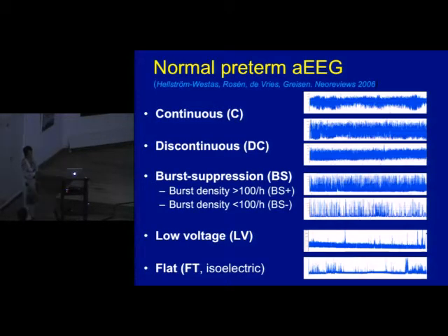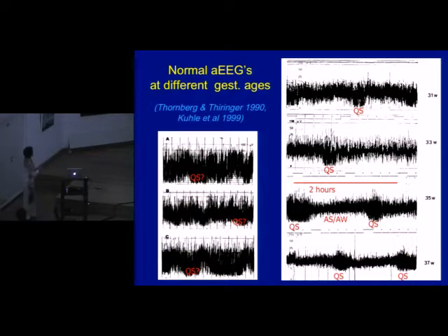And if we look at patterns in premature infants, then we could say that even at 25 weeks we have patterns like this. But if we have babies with patterns like this, it is abnormal, even in very immature babies. And this could be either medication, like morphine or phenobarbital, but it could be another clinical condition as well. So even in premature infants, these patterns are abnormal. These data are still very valid in the sense of how an EEG in a premature infant looks. And you see that there is some cycling pattern even in those very premature, immature infants.